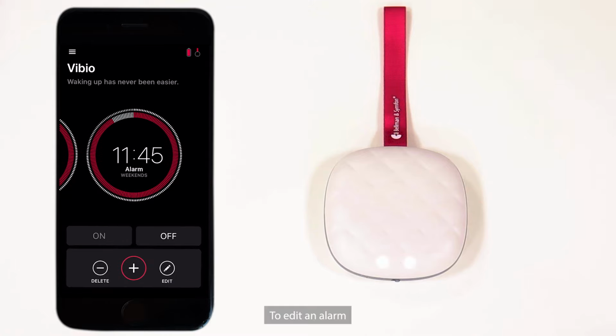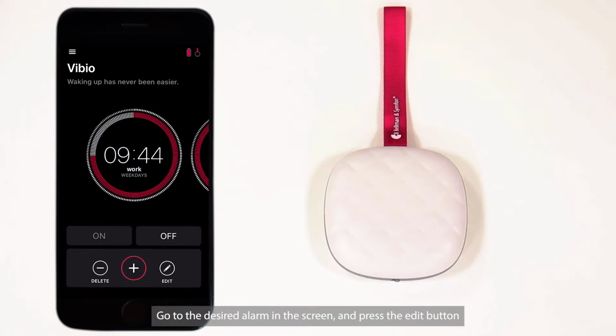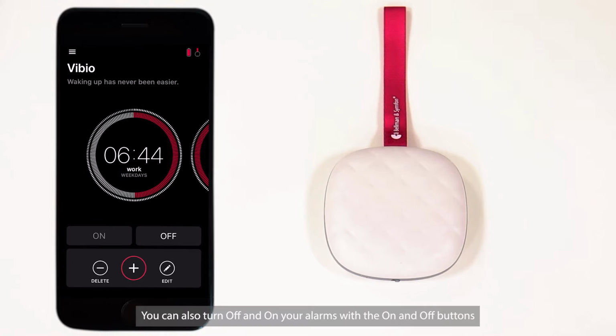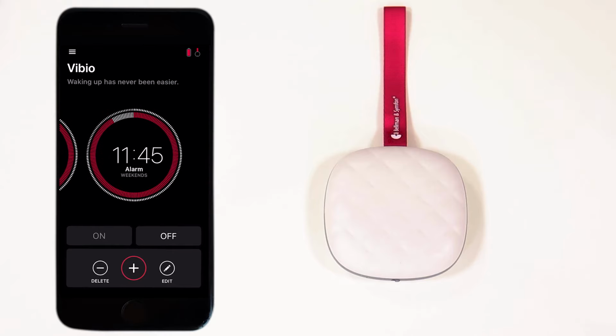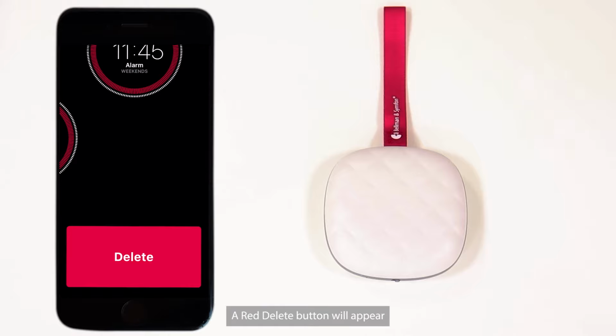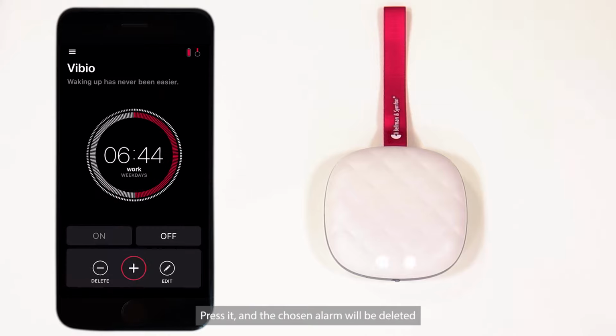To edit an alarm, go to the desired alarm in the screen and press the Edit button. After editing, press Save. You can also turn off and on your alarms with the on and off buttons. Off will deactivate an alarm, and on will reactivate an alarm. To delete an alarm, press the Delete button at the bottom of the screen. A red Delete button will appear. Press it, and the chosen alarm will be deleted.